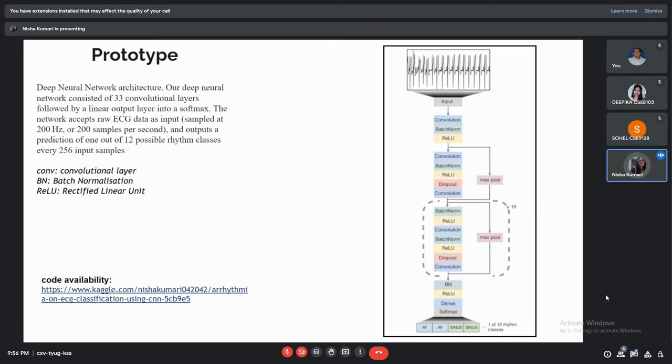So it has become the default activation function for many types of neural networks, because a model which uses this activation function is easier to train and often achieves better performance. Then comes the other convolutional layer. And here we can see one more added layer, which is the dropout layer. Dropout is basically a technique where randomly selected neurons are ignored during training.